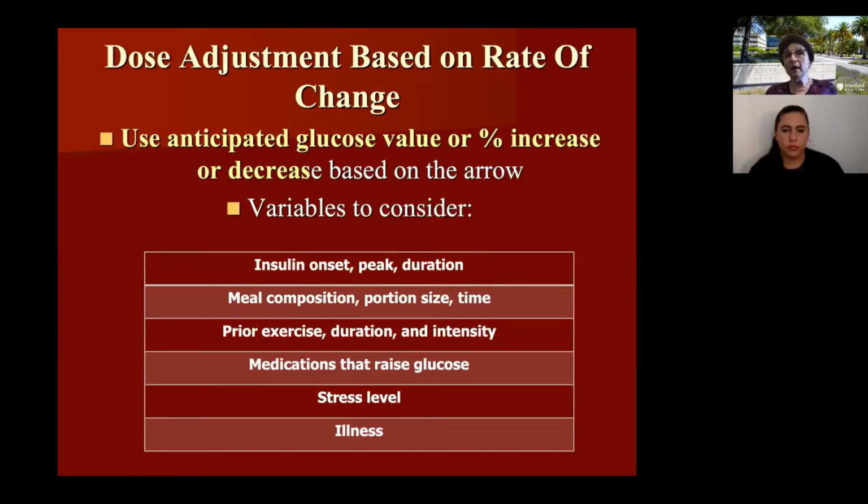Otherwise, the pump will kick in and give you more insulin anyway, and that would be a slower correction than if you give yourself a little bit more insulin preemptively. So there are variables to consider for those, and a decrease would be done in a similar way.